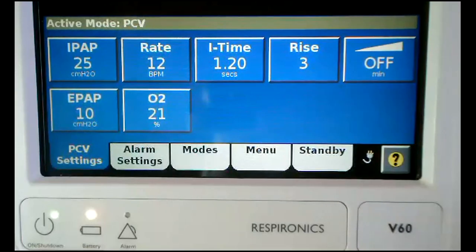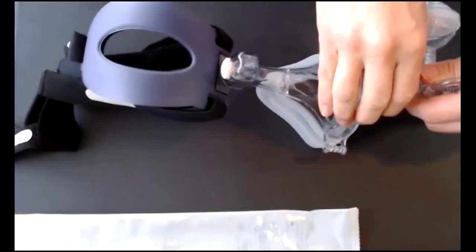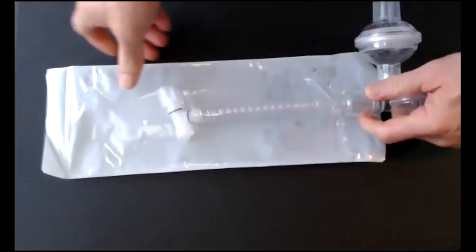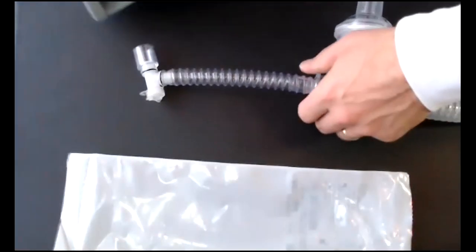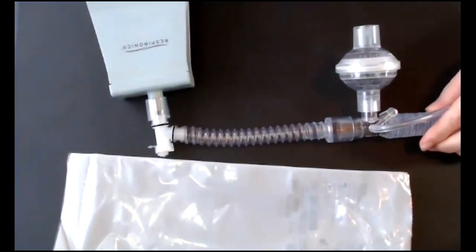You will also need to consider your humidification device for an invasive patient. For the connection where the mask normally connects, you'll need to connect a flexible trach adapter, a swivel, an inline suction, and then that will connect to your ET tube for your invasive application.